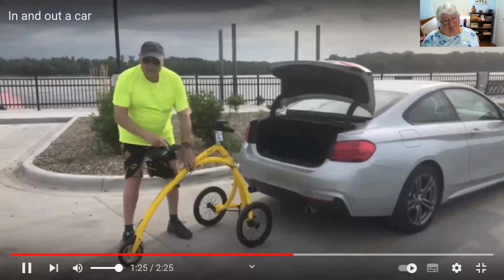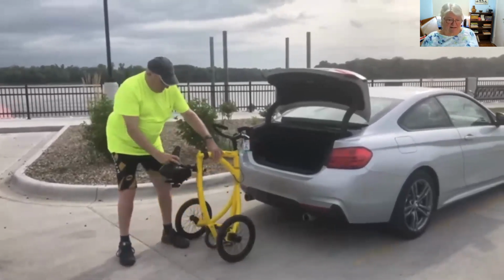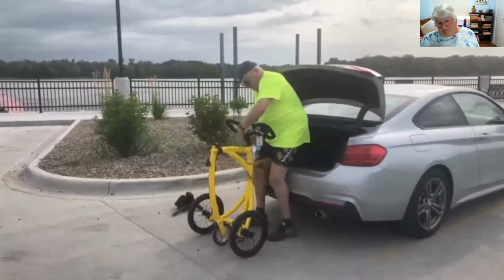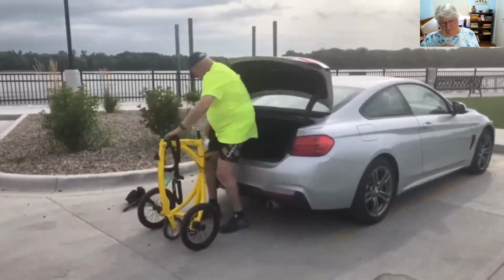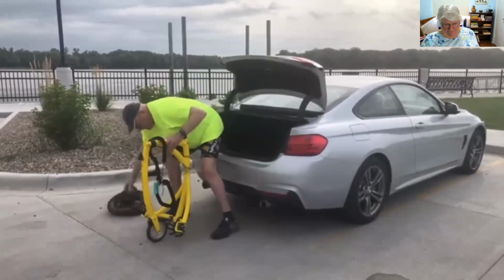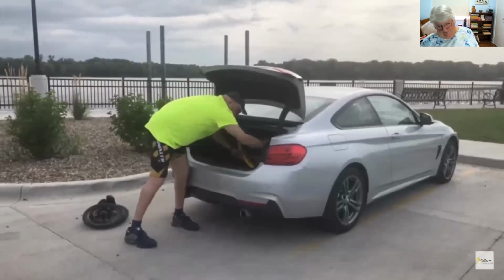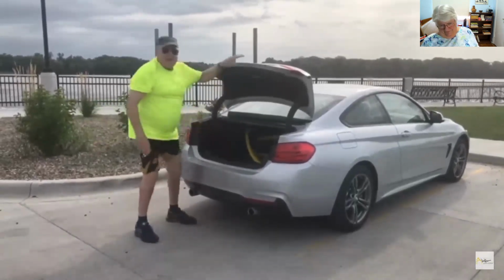Okay, I finished my ride. Now I'm going to disassemble it. The sound is very quiet, but he's not really saying anything. Just hold it up, put it on a stand. Second, you take the seat off. I'm doing the clamp. Put that on the ground. Next, you loosen your handlebars. You can take them off, put them on the frame, and you take off the wheels. I think you should just pivot it up on the frame of the car. The frame is actually quite small. The trunk. Put the wheels in. Away I go.